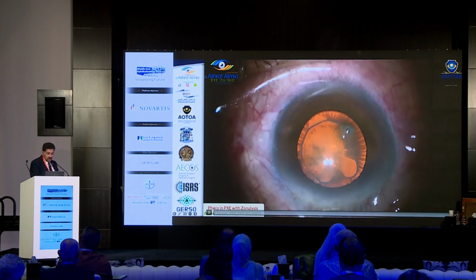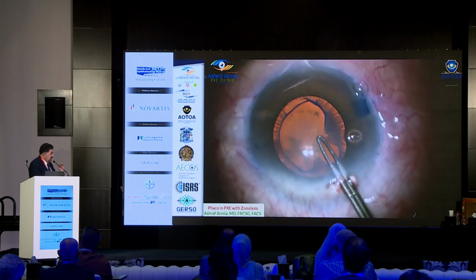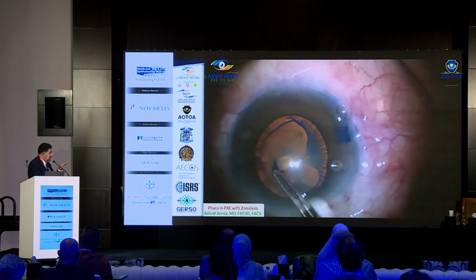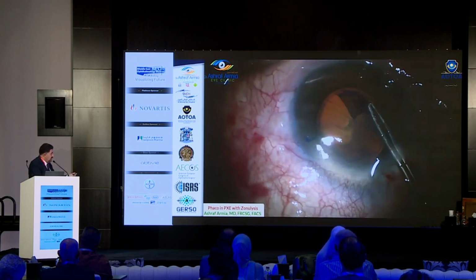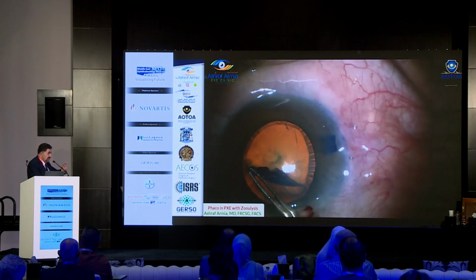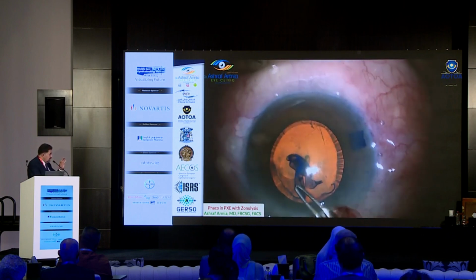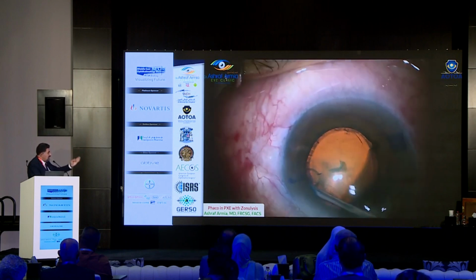So we are going to start. The rhexis is very important because you need the rhexis either for secondary optic capture, or to put the lens in the sulcus, a lot of things. So take your time in your rhexis, staining mandatory, even if you see a red reflex, and as large as you can, but not too large, and continuous and central.